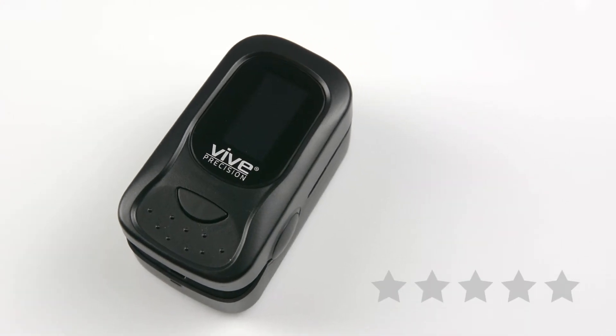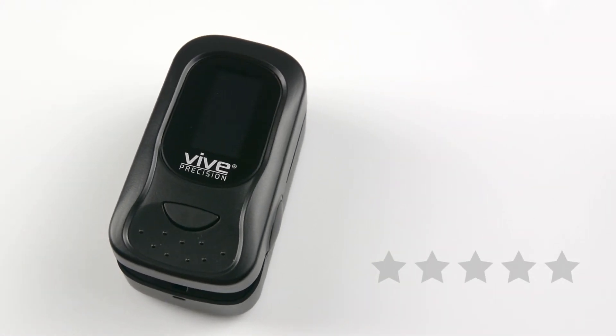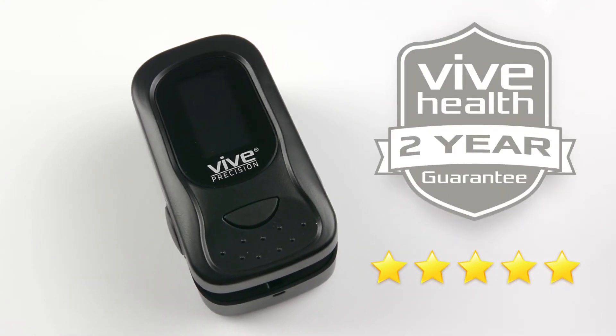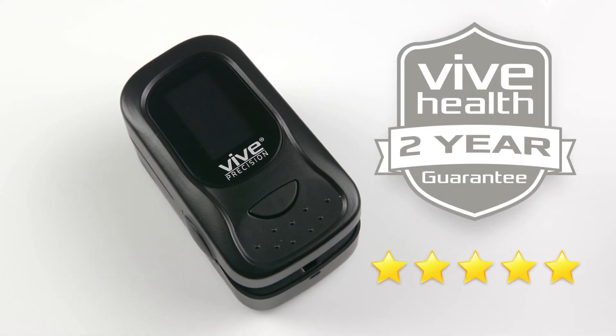The Vive Precision Pulse Oximeter is trusted and proven. There are hundreds of five-star reviews. Plus, it is backed by an unconditional two-year guarantee. You can't beat that anywhere.